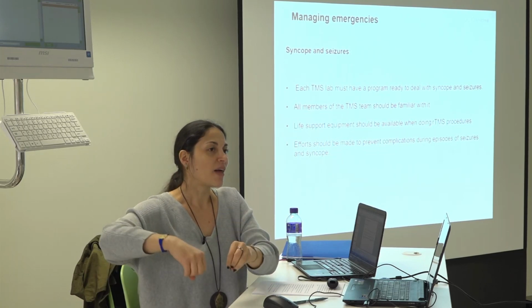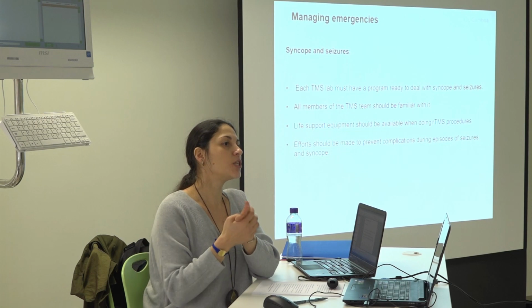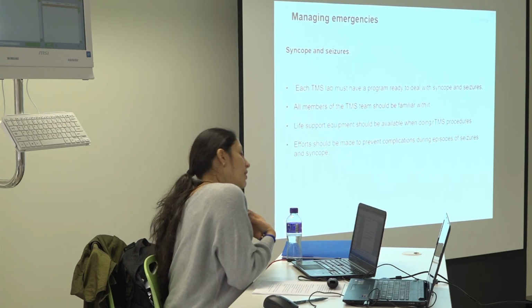But the most important thing is having cables and things on the floor and all this kind of stuff. You need to have a space where this can happen, yeah? When the seizure has passed, you do what your doctor will tell you to do. Each place will probably do it differently. But what is basic is that when a person is having a seizure, you don't want to hold the person. You don't want to leave them where they're going to fall. You don't want to leave things around, so just empty the space, put them in a space, allow them to have the seizure, and it will pass, and then do what you need to do, put them on their side or whatever.